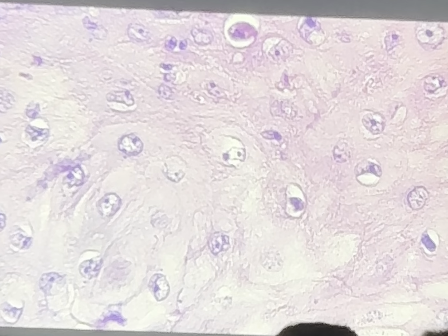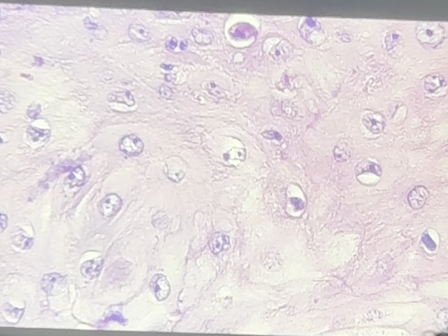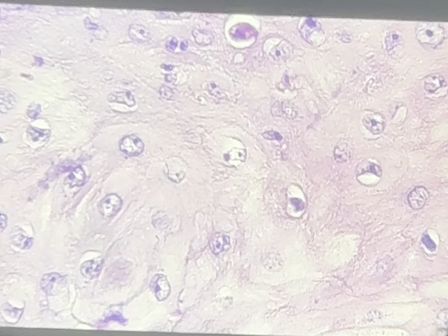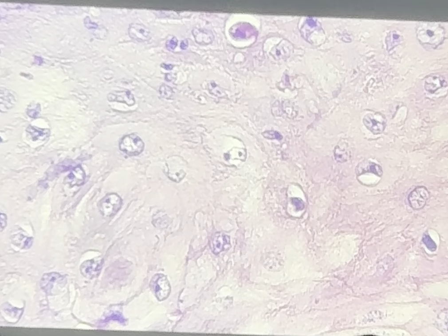Sometimes squamous cells are difficult to appreciate, or you might not be able to tell a squamous cell carcinoma from a very solid type of adenocarcinoma. But if you see intercellular bridging, if you see keratin pearl formation, that gives you a hint that you're looking at a squamous cell carcinoma versus a different type of carcinoma like adenocarcinoma, which is glands. Okay? Squamous cell carcinoma. And this is the skin.